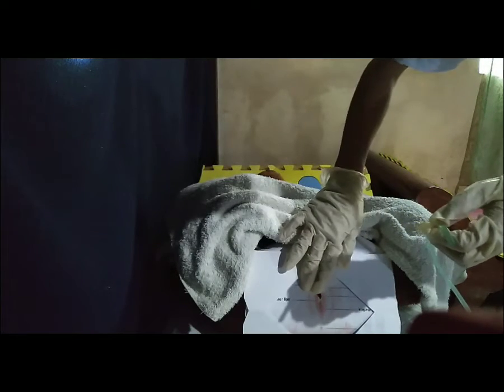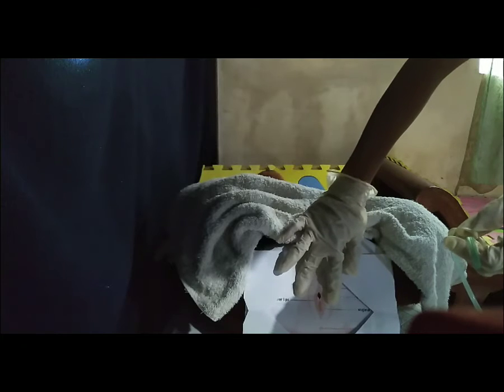Here, I will start holding the catheter. As you can see, I don't have a real catheter here, so I just made a substitute. And ideally, the tip of the catheter should be coated with lubricant, but since I don't have one, let's just say that ideally it is lubricated. Using our non-dominant hand, we're going to spread the labia to expose the urethra and to properly insert the catheter into the urethra.